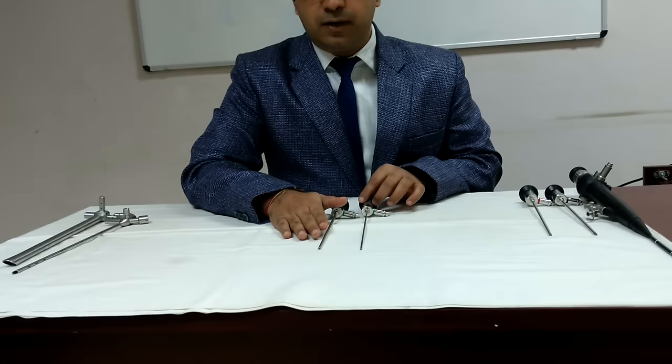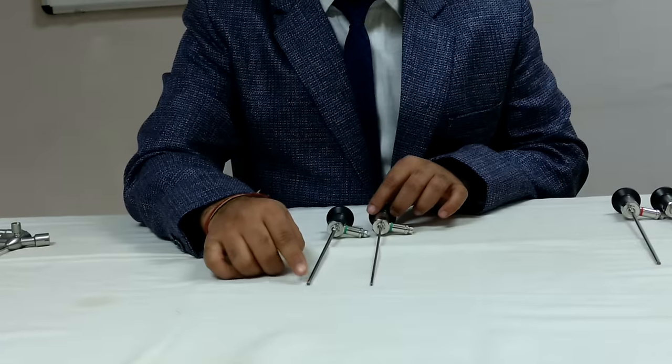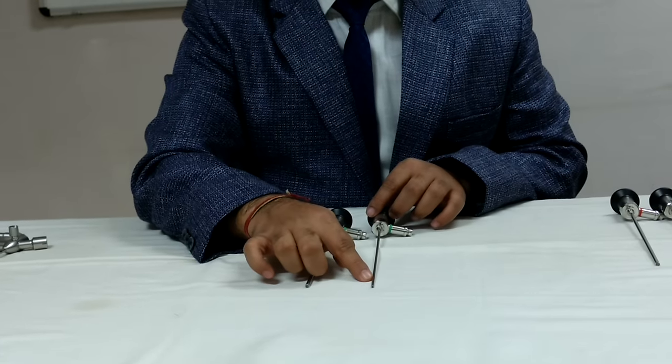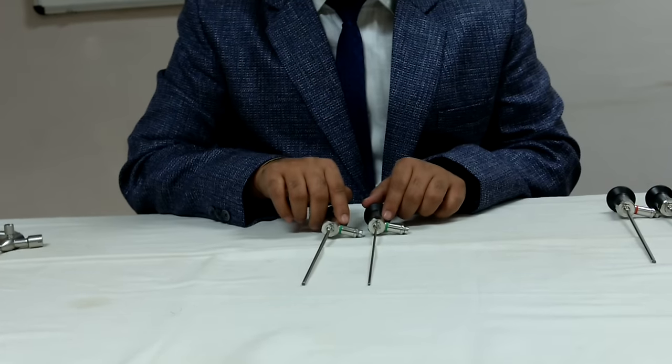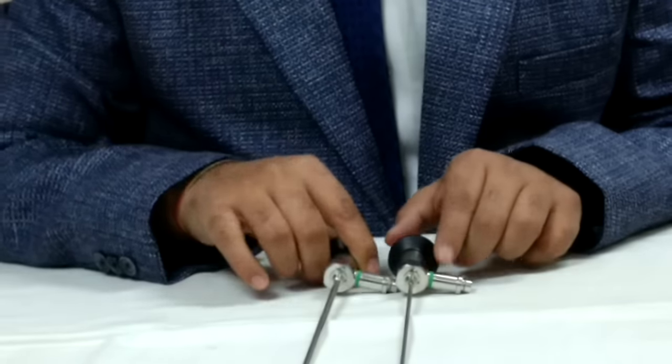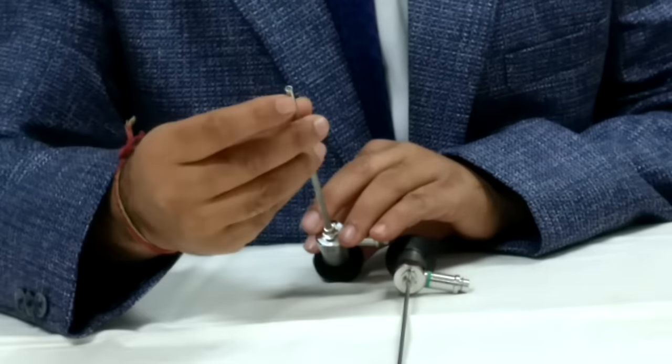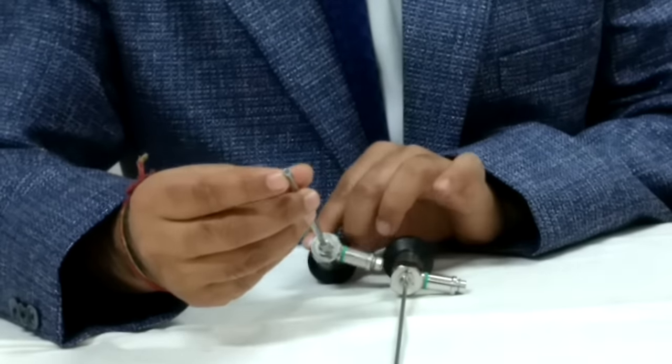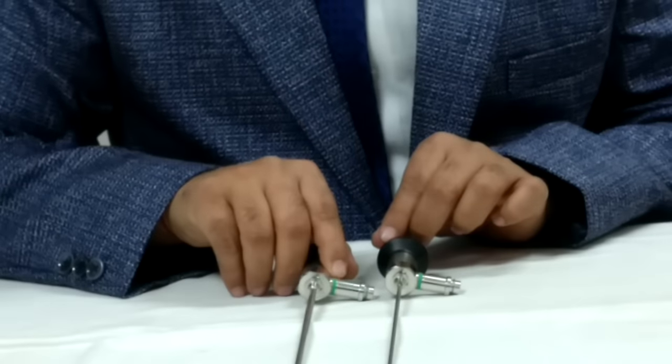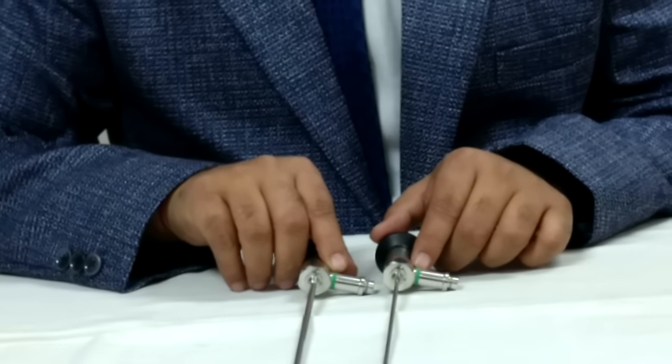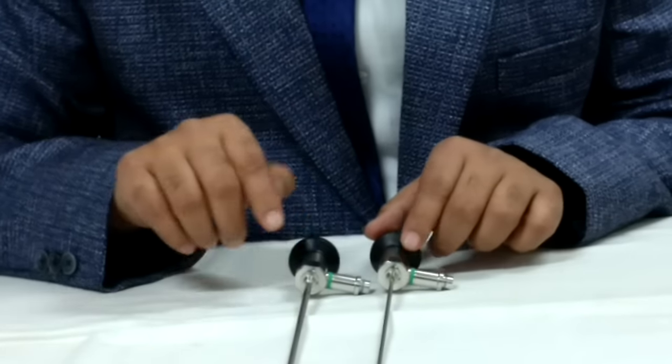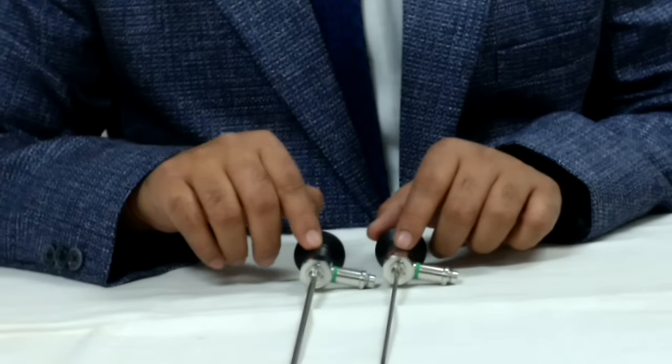Only difference is this is adult endoscope. This is pediatric endoscope. This is 4 millimeter diameter. This is 2.7 millimeter diameter. Otherwise, looking at this green, I will understand this is 0. So you need not always see the end to know what degree endoscope is there. You just see the ring, you will know which degree endoscope is there. Though it is always written also over the endoscope.